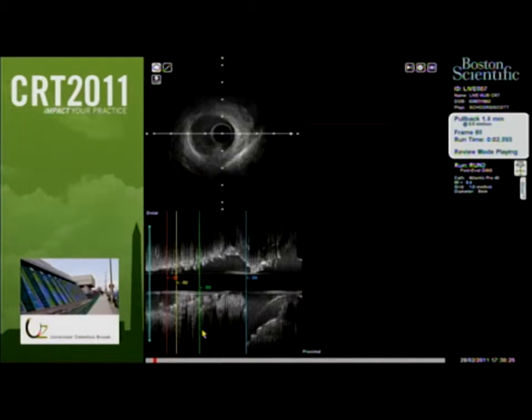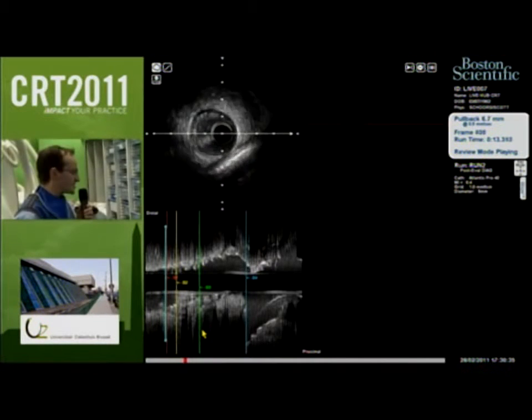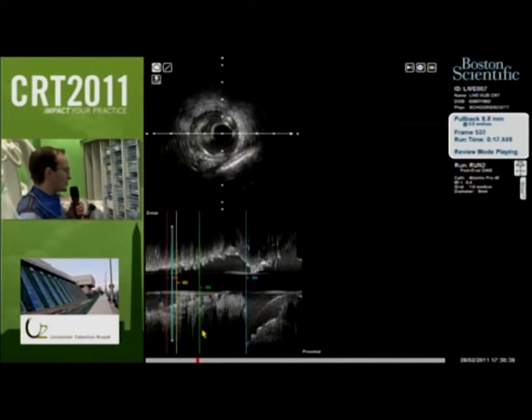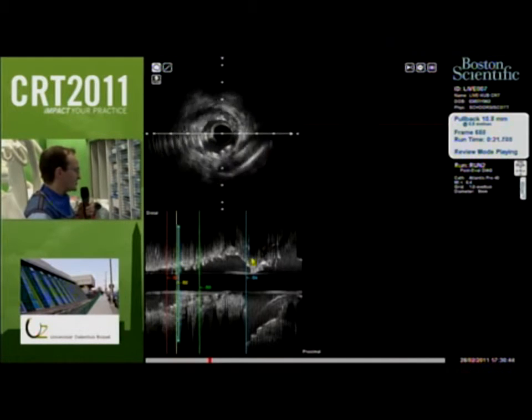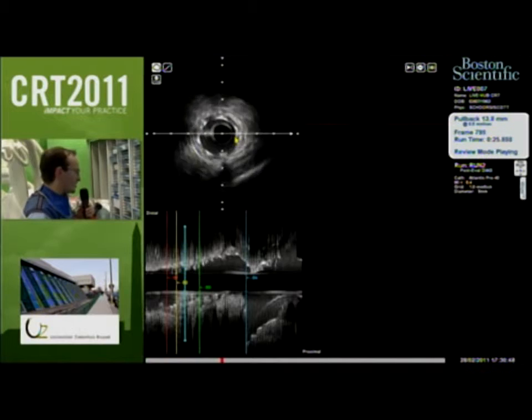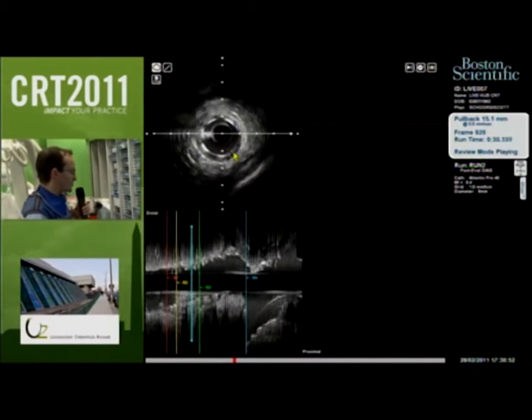You see that this is a vessel that is 2.5 in diameter, and at this level we see a small bifurcation and some more plaque. The distal diagonal was pretty nice, and we see the transition of the stent that was put there, and there was between 12 o'clock and 3 o'clock some suboptimal apposition, so we went for post-dilatation based on this.